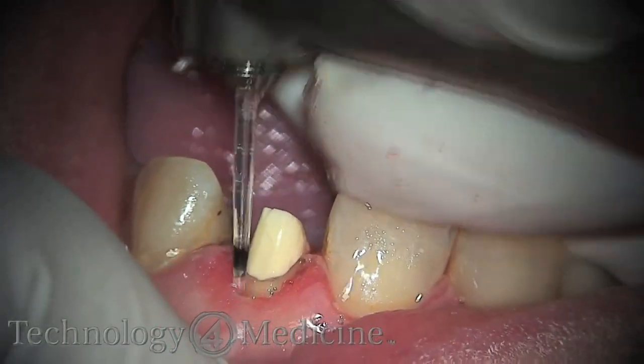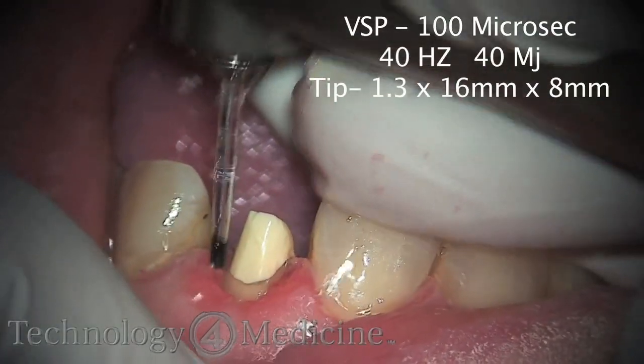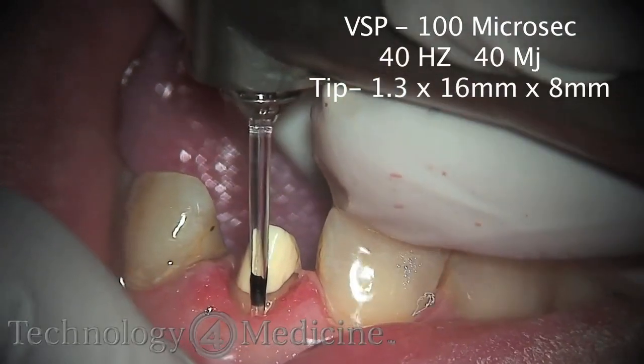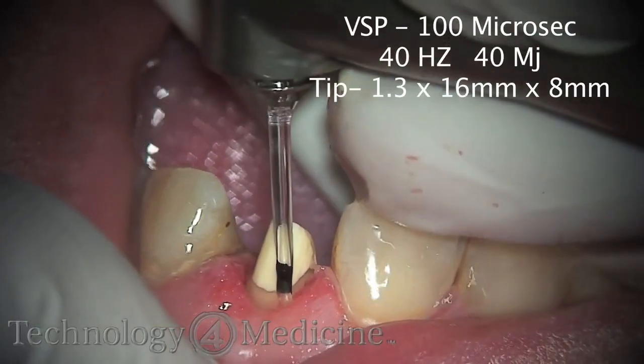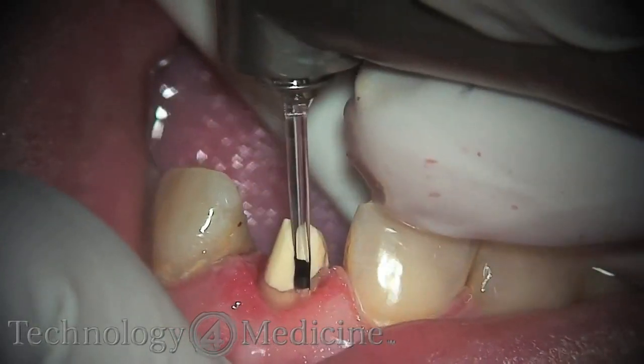Once you have contoured the tissues where you want them, you go through and reestablish the biological width from the bottom of your prep to the bone, making sure that it is three millimeters. The laser is an incredible tool to do this.